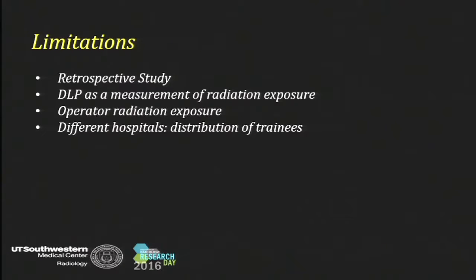It's probably insignificant. And the difference between the hospitals and distribution of trainees: you have a lot of residents at Parkland Hospital. Not many residents are at Clements Hospital doing lung biopsies at this point, which means you have to teach them, which means you probably have to adjust your needle a couple of extra times, get a couple more images. And we were showing that despite using twice the number of images, you're still saving on radiation, you're not losing efficiency, your complications are not going any higher.